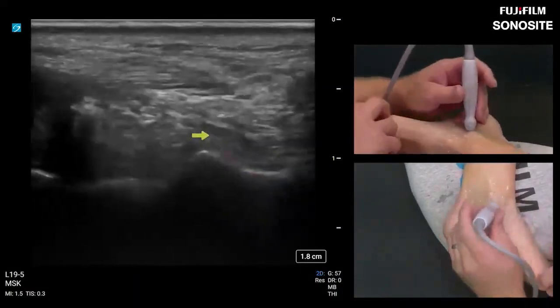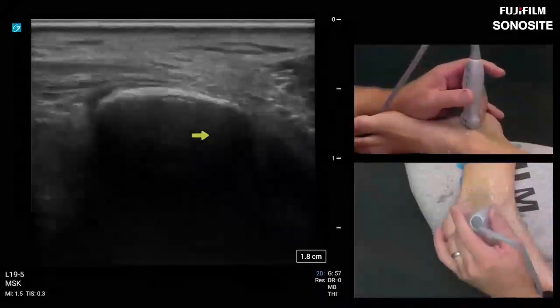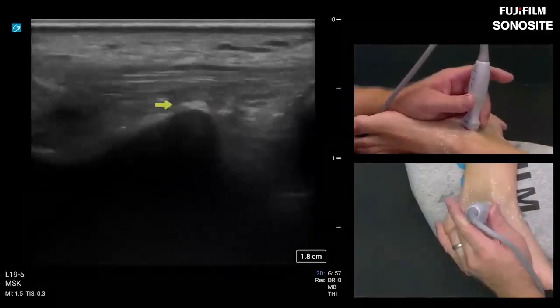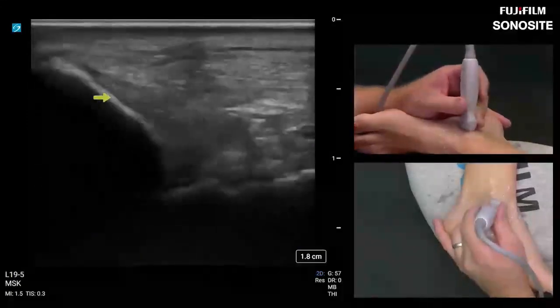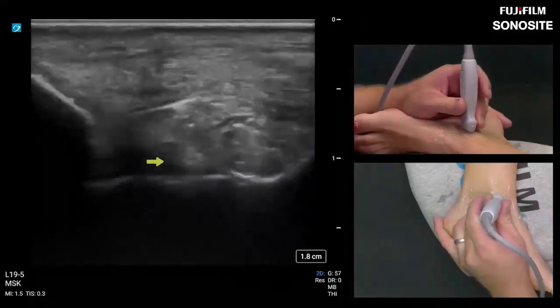Now let's move on over to tibial calcaneal. So we need to see that sustentaculum tali, which is here. A little smaller field of view, so seeing the broad ligament all in one shot is not going to happen. So it's really important that you keep a bone in view. So here medially, here's the malleolus, superficial layer, deep layer. You just kind of keep that in your mind.